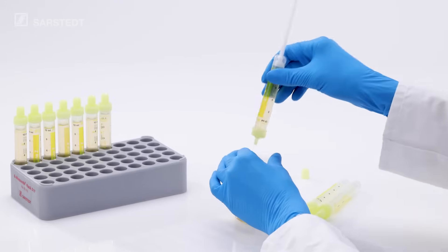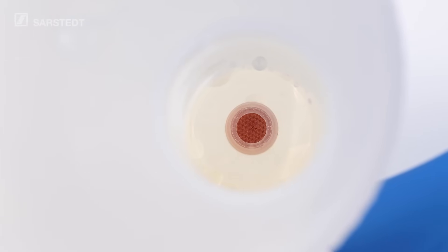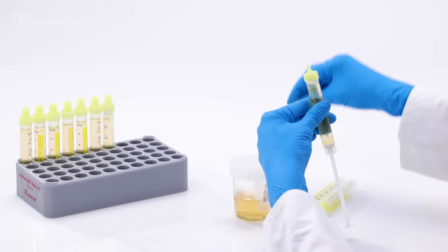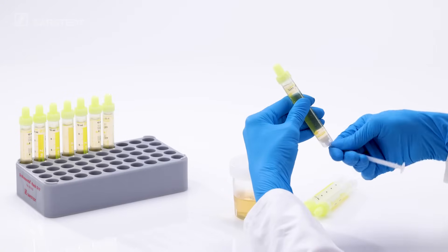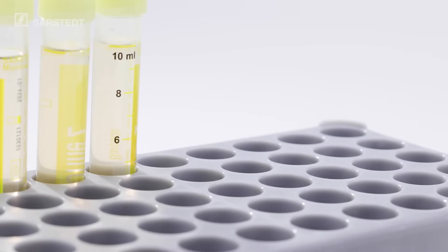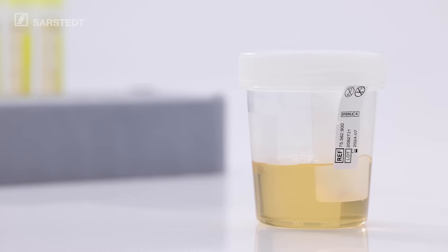When the Urine MonoVet is removed, the NFT Urine Cup is immediately, tightly and hygienically sealed again. Close the MonoVet again with the stopper and then break off the plunger. If necessary, you can take further specimens from the NFT Urine Cup. Finished!